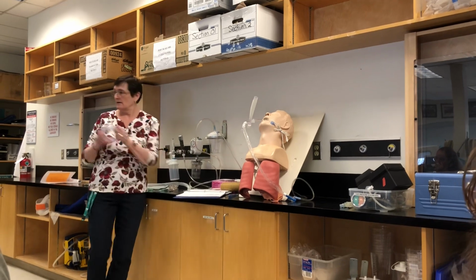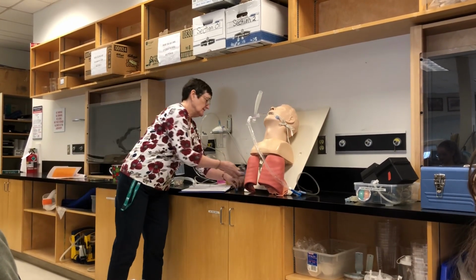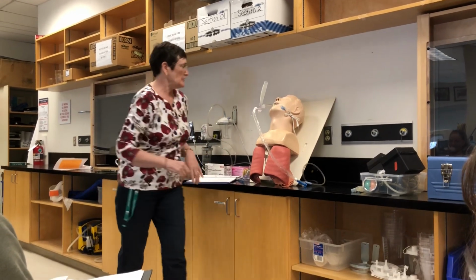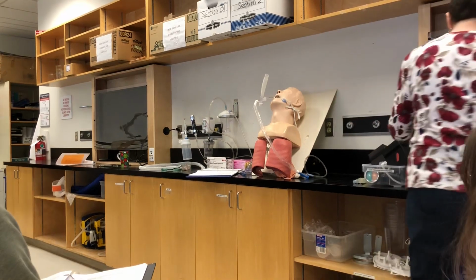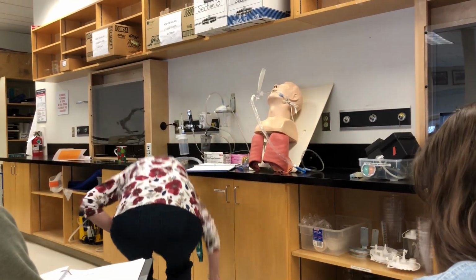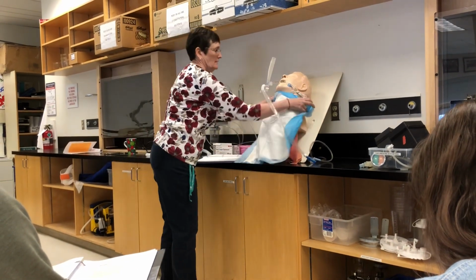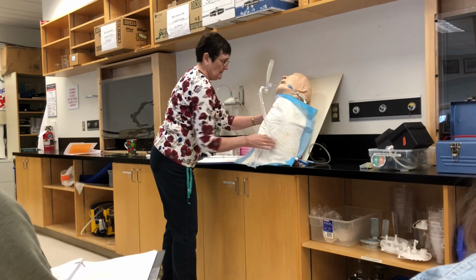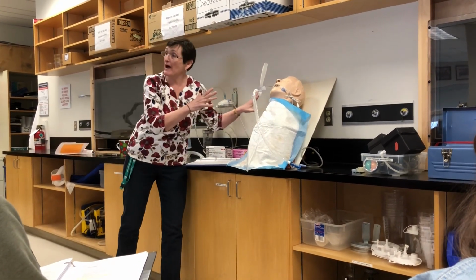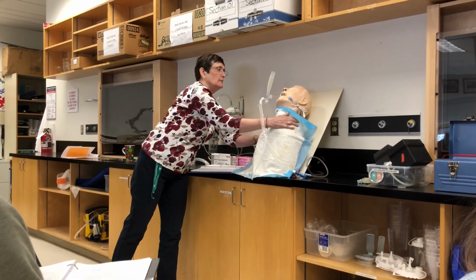Have a drop cloth or something for the chest? Yes. So I've got my mask for my patient. I'm going to put something on their chest. Okay, the patient can be at about a 30-degree angle or sitting up higher if they can tolerate it. Okay, so get really good diaphragmatic movement.